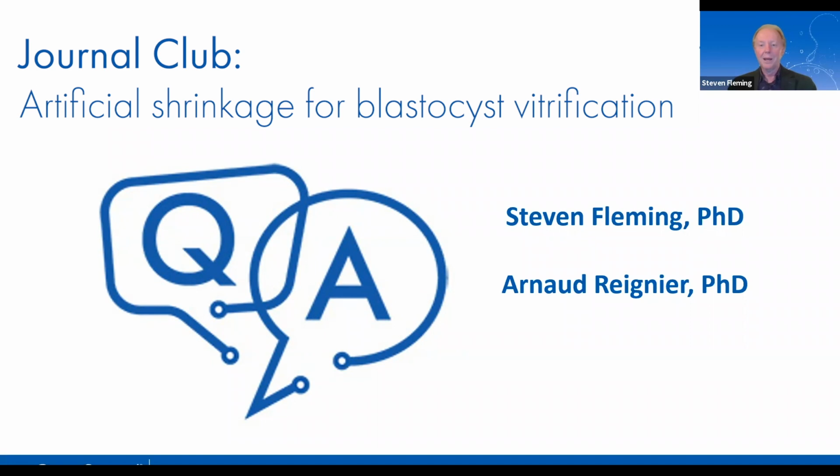Yeah. And Arnaud, have you got any opinion on this? Yeah, I think that it is quite similar to an embryo that you do a biopsy on, because when you perform a biopsy, it is already hatching most of the time, and it works really well. So I don't think that it is a bad thing to collapse the hatching blastocyst.